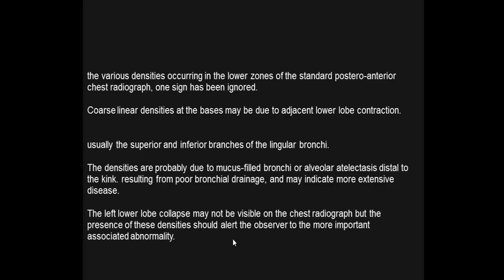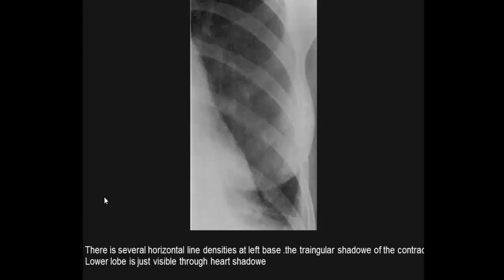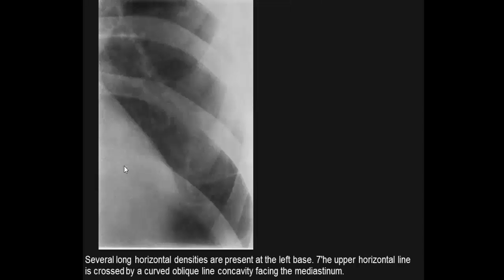Example images show linear density at the left base as a semi-horizontal, concave-upward line indicating left lower lobe collapse. Once the lower lobe re-expands, the line is no longer present. Several horizontal densities at the left base with a triangular shadow of the contracted left lower lobe just visible through the cardiac shadow are typical appearances.